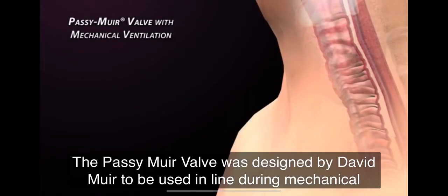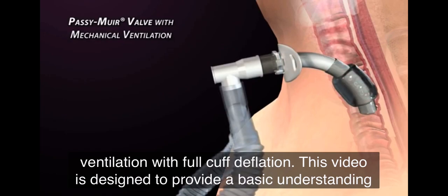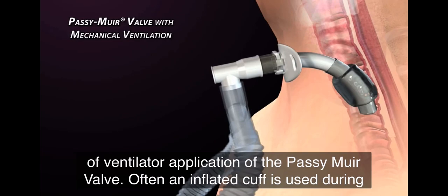The Passy Muir valve was designed by David Muir to be used in line during mechanical ventilation with full cuff deflation. This video is designed to provide a basic understanding of ventilator application of the Passy Muir valve.